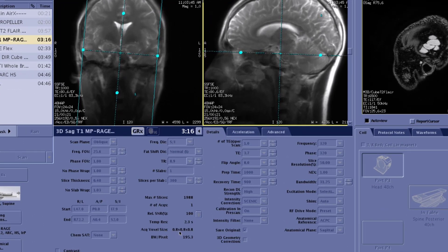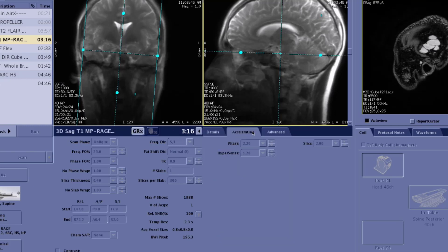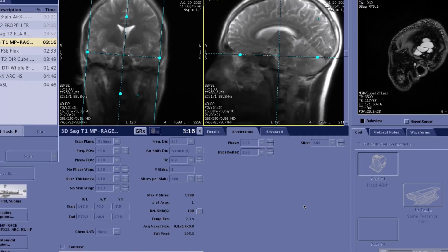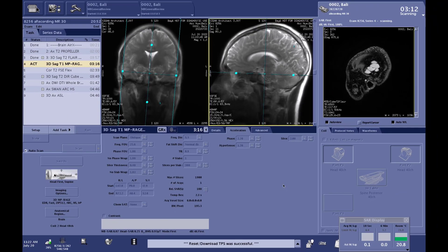It will be 0.8 by 0.8 by 0.8, so isotropic in all three planes, and the scan time for that MPRage will be only 3 minutes and 16 seconds. Because we are with Air Recon DL not worried about the noise, we are able to accelerate with our Hypersense technique on top of that, which I would never have done without Air Recon DL. It's nice to have a 3-minute 16-second scan at less than a millimeter resolution, covering the entire brain.